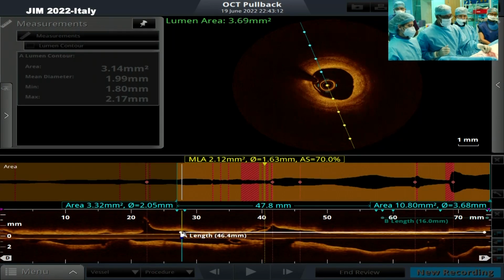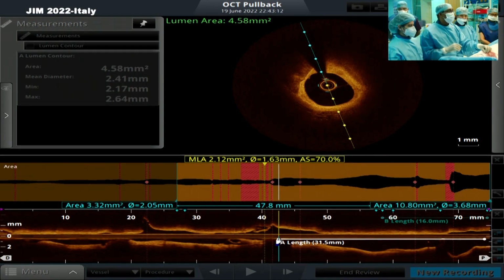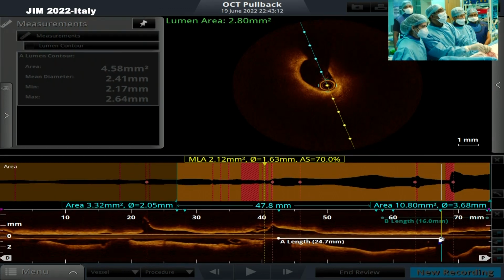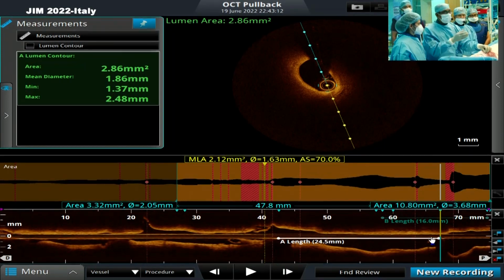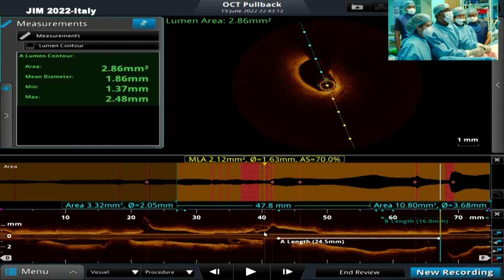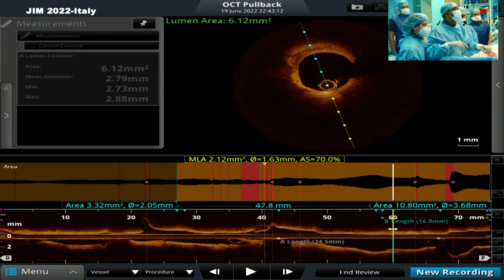Well, let's convert now from the CTO and the OCT into a bifurcation lesion. That's what this is now. We have a 0-0-1 bifurcation with a rather wide angle, and it is not impossible. The circumflex is huge. It's not impossible you're able to nail this ostium if you wanted to. Of course, you don't have to, but I'm saying that's an option, perhaps my option.